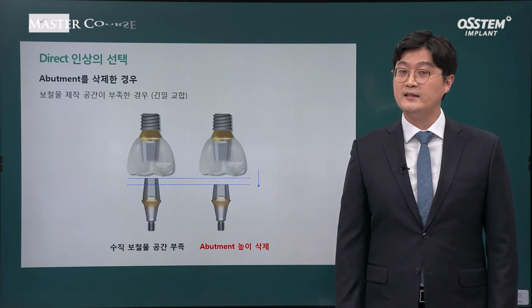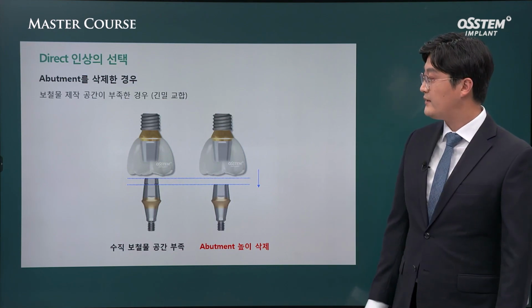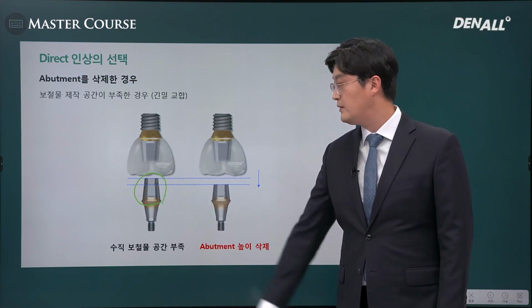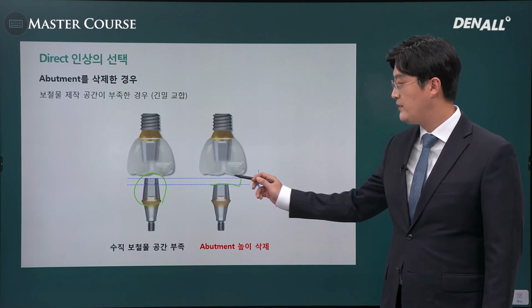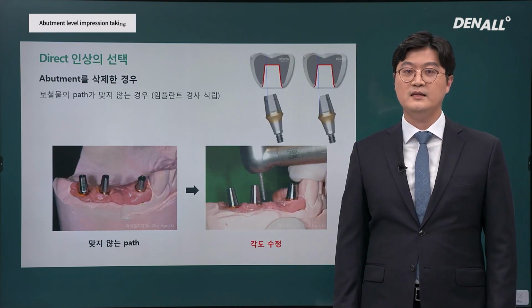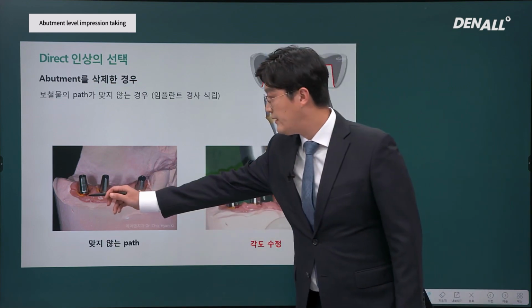If an abutment is reduced, a direct impression should be taken, because a stock lab analog based on a stock plastic cap is a copy of an abutment that is not reduced. So if an abutment is reduced in height or on the side, the lab analog will not work. So direct impression taking is the only option here.